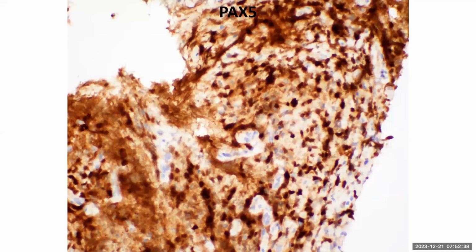PAX5 is a general marker, a transcription factor for lymphoid cells, and this is positive, and that removes any doubt that these are lymphoid cells and any artifacts of immunostaining, etc. So we're looking at an atypical lymphoid infiltrate.